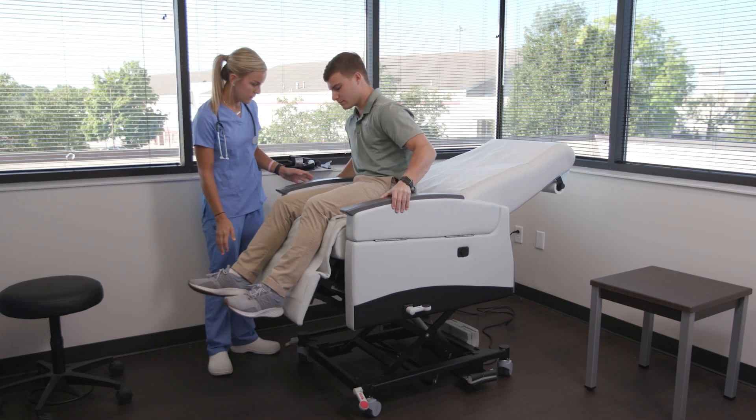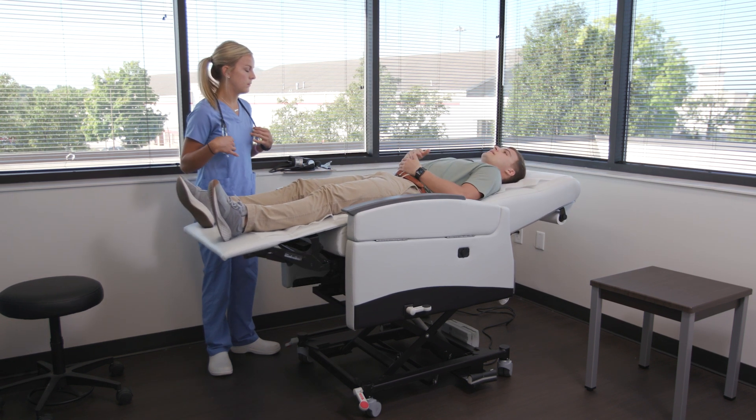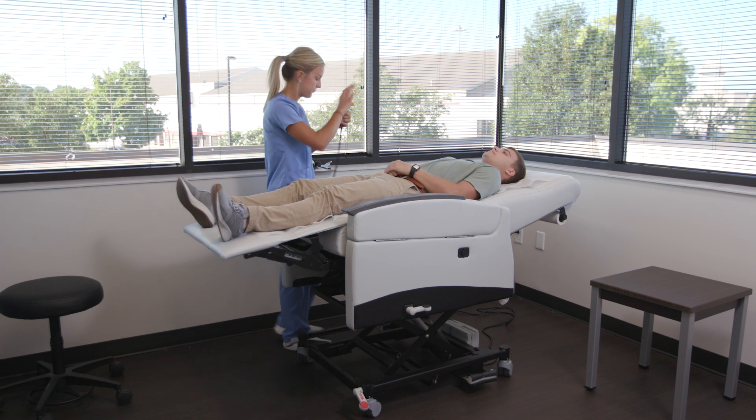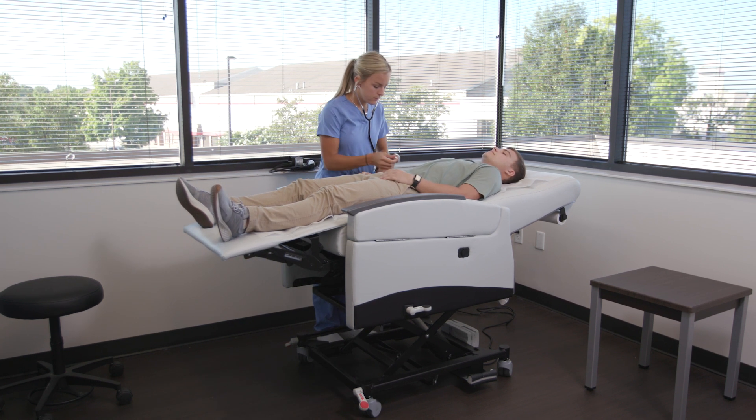The reclining function can be operated while in the lowered position or while lifted by either the patient or the caregiver. The locking leg support mechanism prevents the footrest from closing accidentally while the user is in the lifted position, as well as providing security for those who may have restrictions in the movement of their lower body or torso.